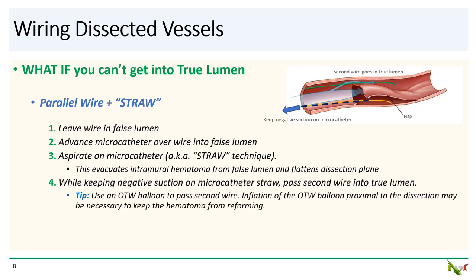Finally, pass your second wire — the parallel wire — into the true lumen while keeping negative suction on your microcatheter straw in the false lumen. You'll need a second set of hands to do this, like your fellow or scrub tech. Here's a tip: I suggest using an over-the-wire balloon to pass your second wire. With constant inflow of blood, negative suction on the straw may not be sufficient to keep the false lumen down. To prevent this, you can inflate your over-the-wire balloon gently proximal to the dissection and occlude the vessel. This prevents further blood inflow into the false lumen and maximizes the ability of your microcatheter straw to keep the false lumen down and the true lumen open for your wire to pass.